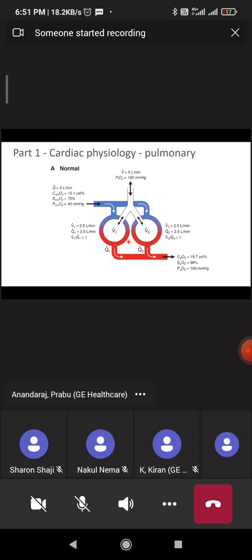But anything beyond the Y piece which does not come under the purview of bias flow, whatever you are adding, a nebulizer left in situ, an EtCO2 sensor, an HME filter or a bacterial filter, even the endotracheal tube, everything becomes dead space. That's why, when there is CO2 accumulation or a high EtCO2 value, we tend to minimize these things. We should use as little dead space as possible.